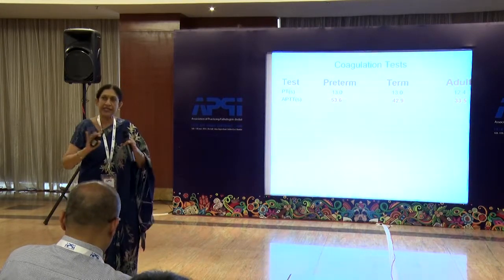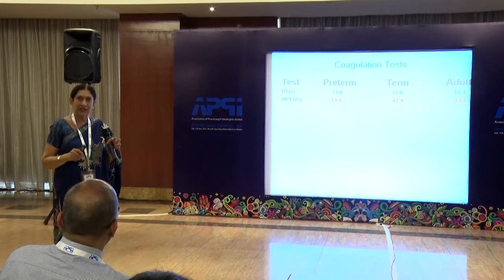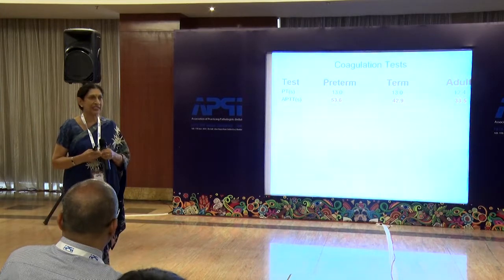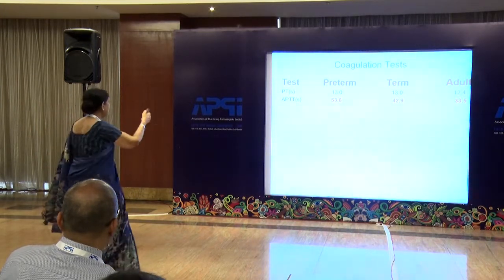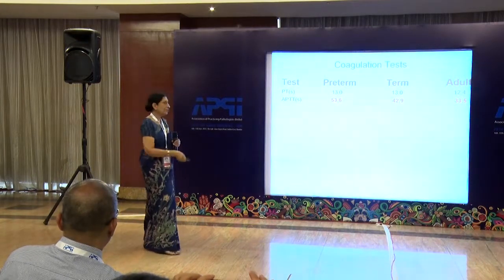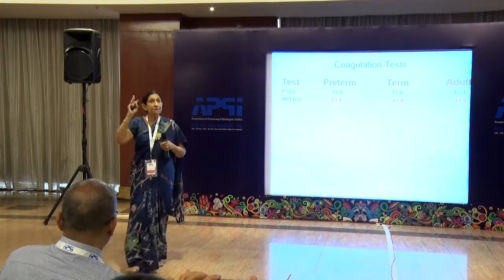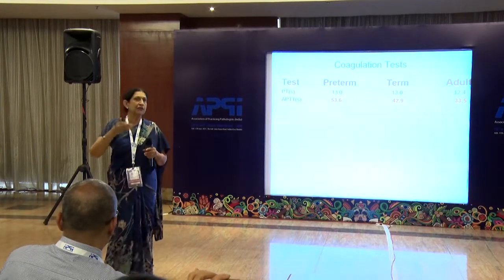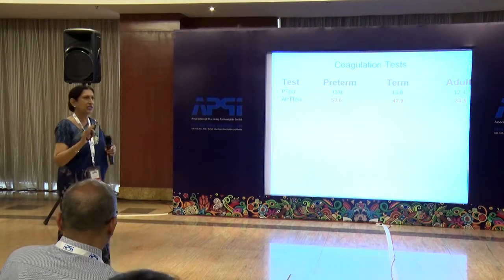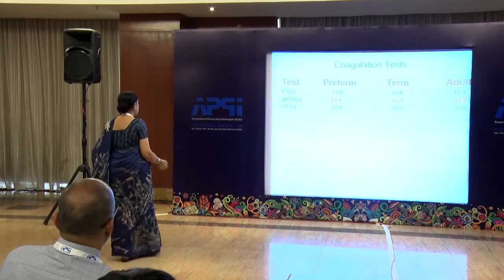All your MNPTs and everything is all adult, 20 samples collected. Nobody will bring a normal, healthy baby to give you a control sample. So please keep this in mind, not to investigate APTT, even up to 2 times in a preterm baby. Don't investigate for factor 8 deficiency and all the intrinsic factor deficiency. It's useless. Wait for some time. Let the baby mature a little.